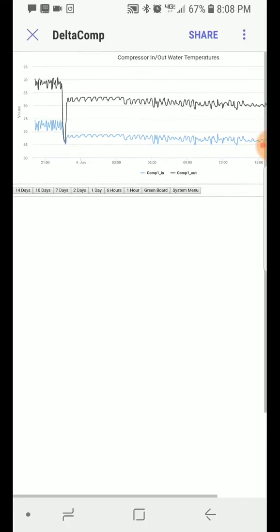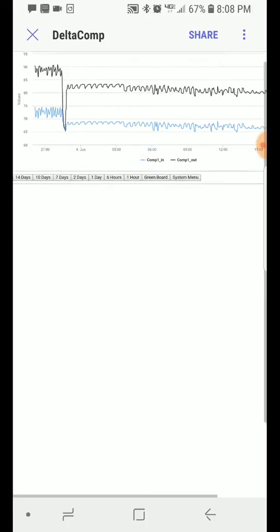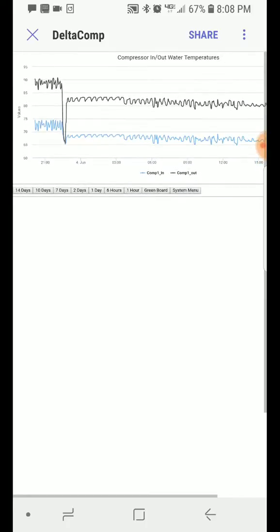So if this were chiller overheating before all of this happened, then the blue line would be going up before they came together. If this was a power related issue on the chiller and the cold head compressor at the same time, then the outgoing temperature would meet the incoming temperature, the black and the blue line would come together, but much slower because the pump isn't running anymore, so it's not transferring heat very quickly anymore.